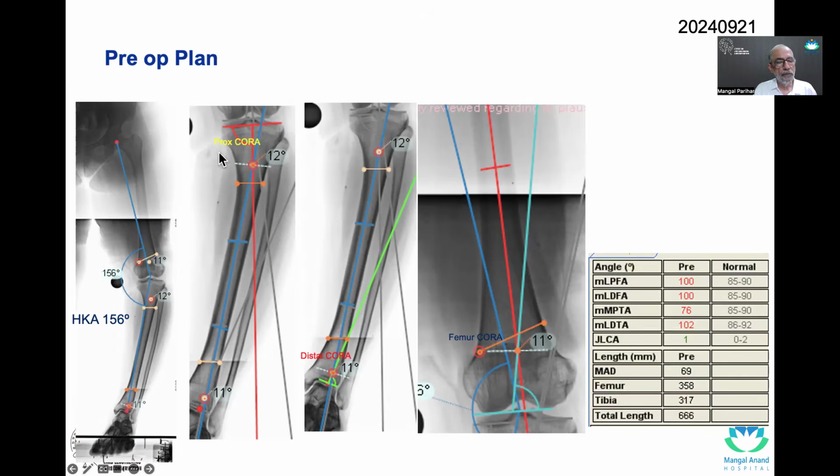But because we want good fixation over here, we are going to do the osteotomy lower down and this osteotomy slightly higher up, right?